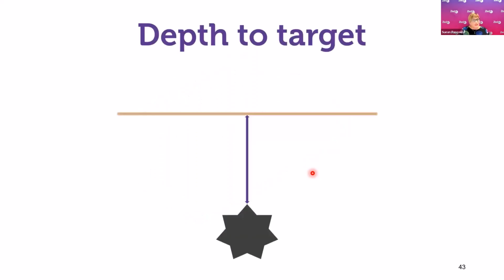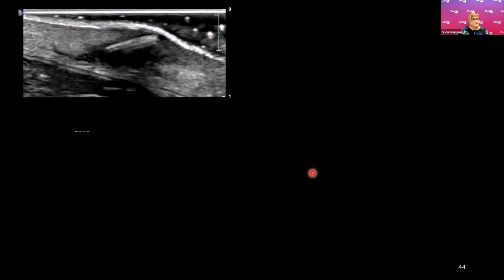The next thing we're going to measure is the depth from the skin surface to the target. So this will give us an idea of how deep in it is, and if you're going for a surgical removal, you'll know how far you need to cut down on it.